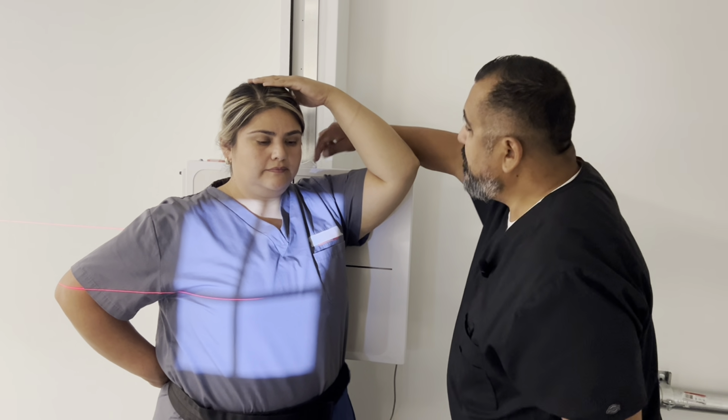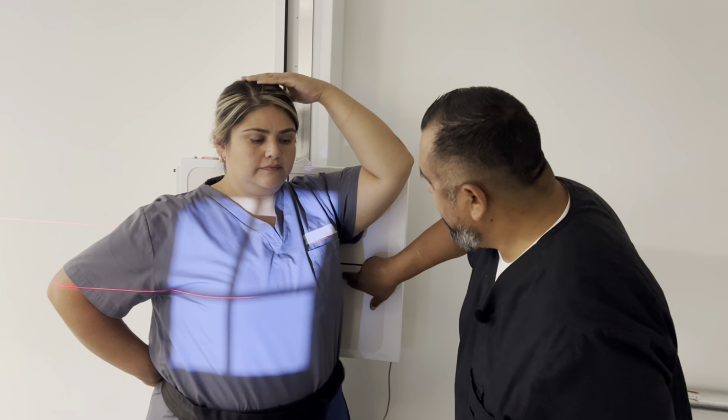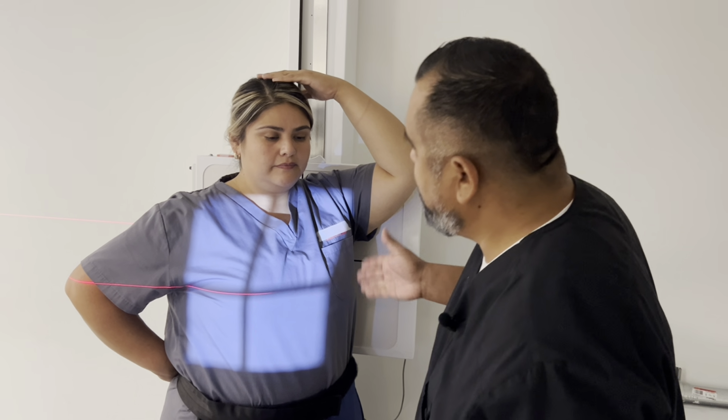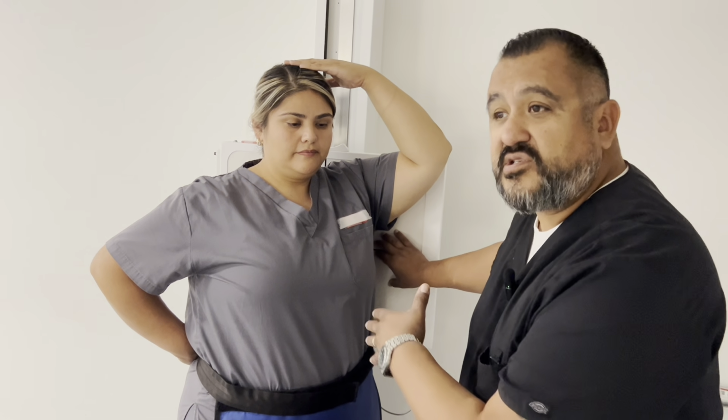I've got my marker in the shoulder area. That's fine. I could put my left marker down here as well, but I'll keep it here. But this is going to be your LPO, and it's going to be for the left lung. If you're using AEC, you turn on this left upper chamber, the side that's closest to the IR. That's going to be your area of interest. Okay, you guys got that?